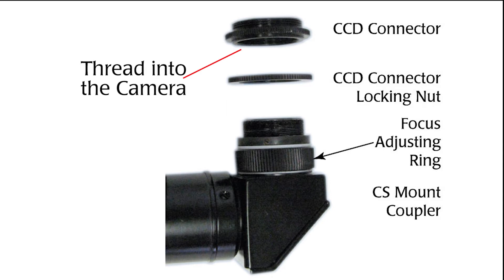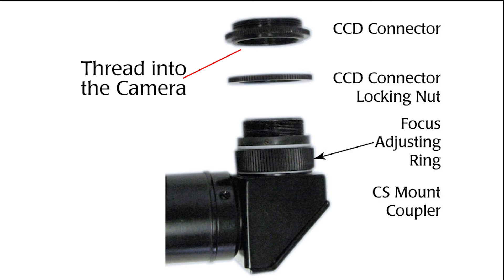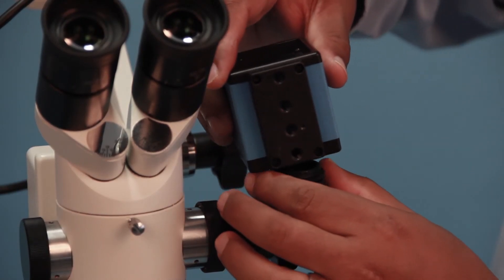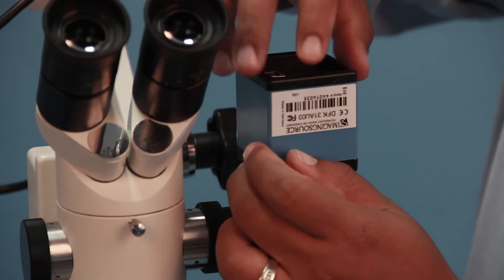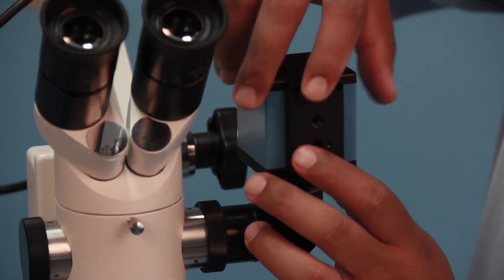Thread the male threads on the CCD connector onto the camera all the way until the CCD connector is butted against the camera. Do not over tighten these connections or they may become difficult to remove.